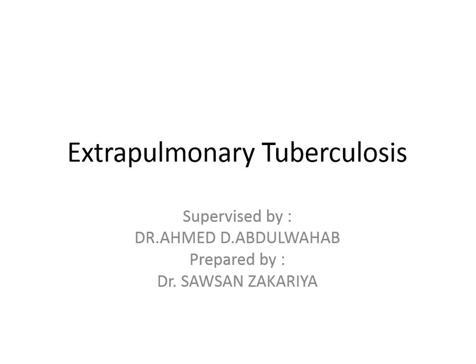Today we have a very interesting and very important subject, the radiological manifestations of extra-pulmonary tuberculosis, and it will be presented by Dr. Sousan.